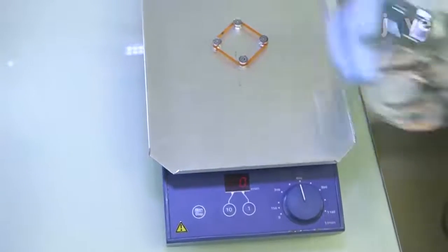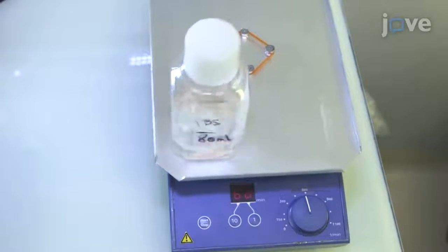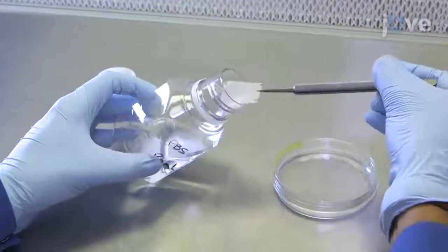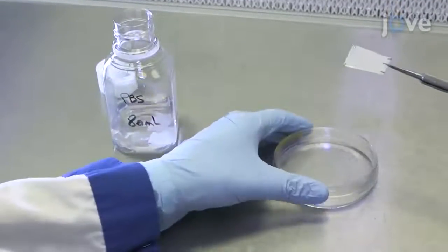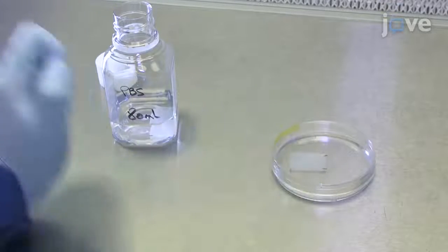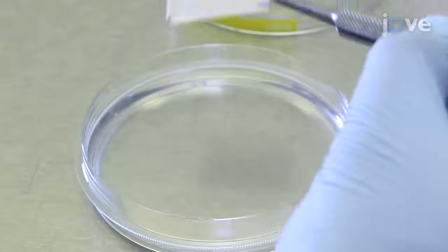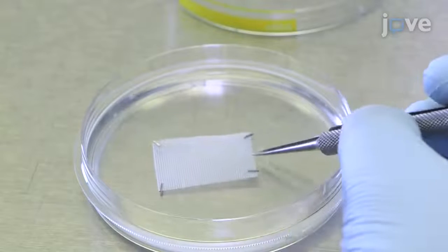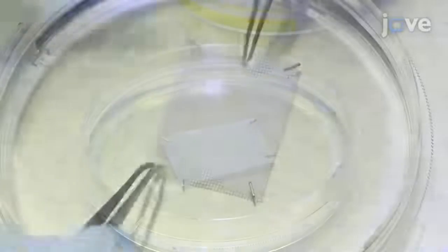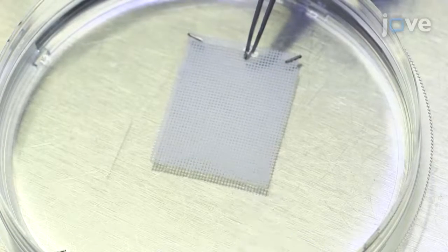After the second round of thermolysin treatment, wash the pieces 2 more times with 80 milliliters of PBS per wash as demonstrated. Then, use long, sterile forceps to transfer the HAMs individually into a 10 cm culture dish containing 10 milliliters of PBS. Next, place one membrane with the nylon facing down in a second 10 cm culture dish of PBS, and detach 2 of the 4 clips holding the membrane to nylon.